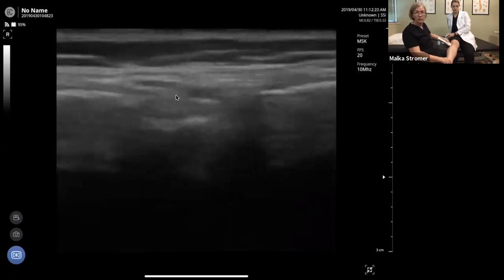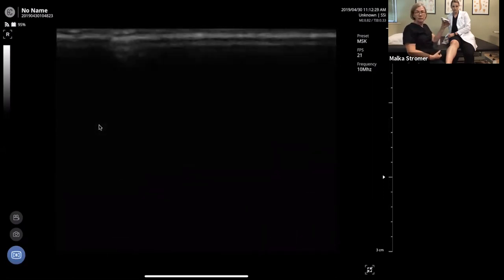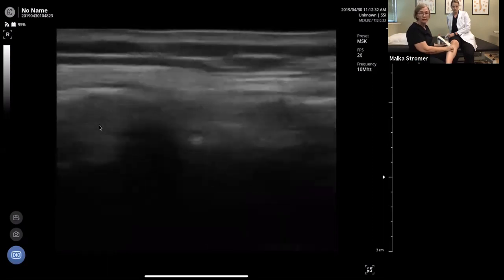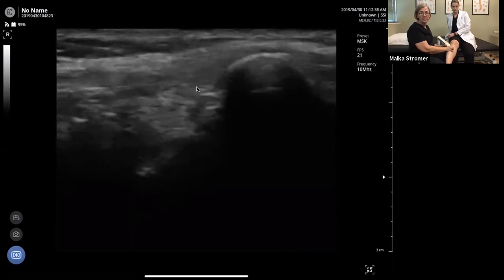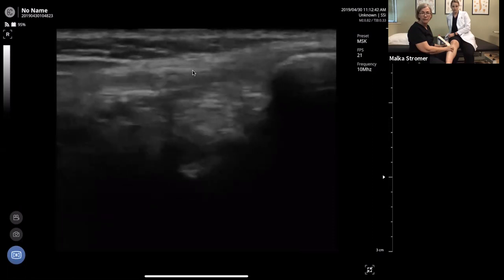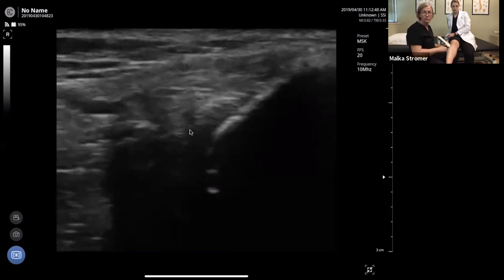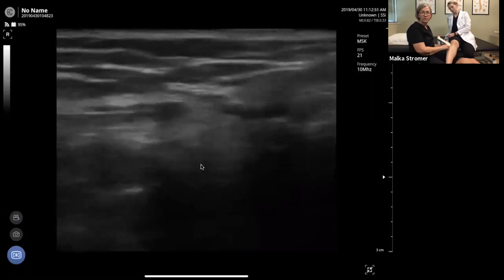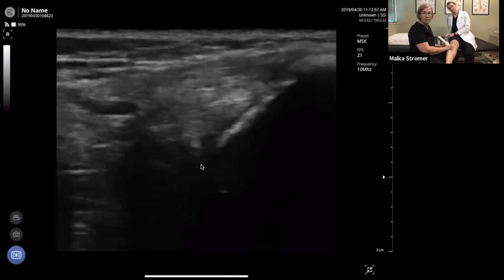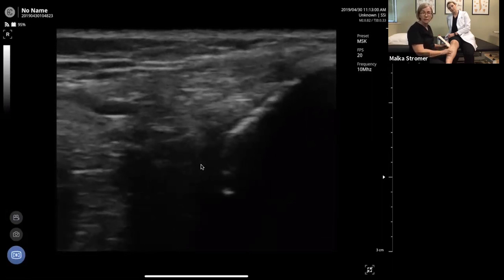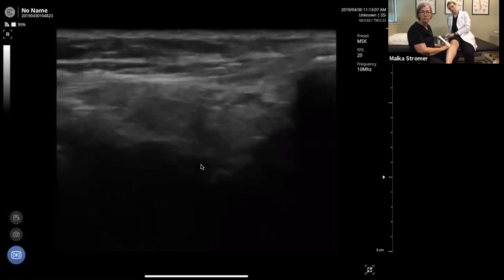Following the IT band proximal, you can see the nice band running in a straight line down to the tibia. For the lateral collateral ligament, you angle down just a little bit to the fibular head — and there is the lateral collateral ligament attaching onto the fibular head. Deep to that is the distal biceps femoris attaching right in through there. Keep in mind the common peroneal nerve is in this area — if patients complain of pain going down the lateral leg with numbness and tingling, look here for inflammation or scar tissue.